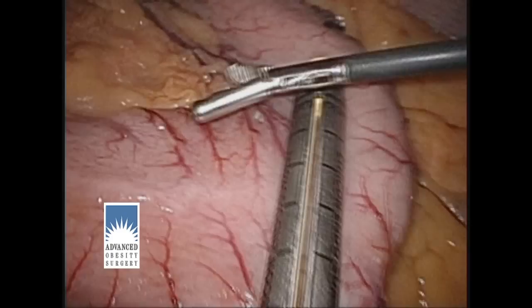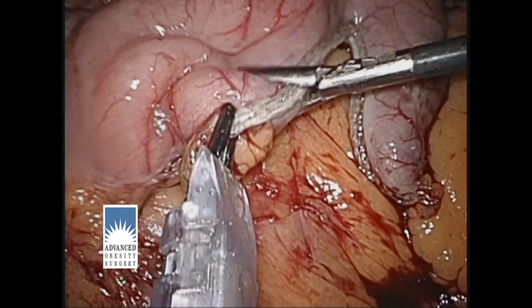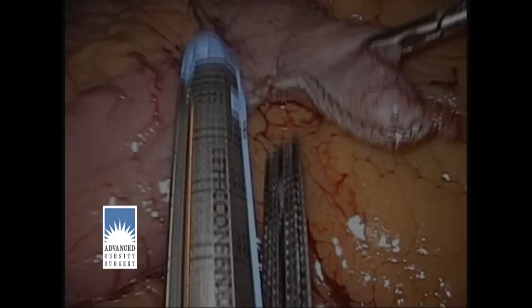What you see to the right of the stapler on screen will be coming out; what you see to the left will be staying in. With the stapler removed, you can see how the staples have been laid down on each side and the stapler has cut between those rows of staples. I now put clips on the staple line for added security and to control oozing along the staple line.